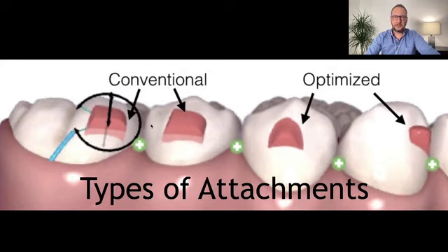The conventional attachments are those that we have available in the software, that we ourselves can place, change the position of, and increase the size of. They have specific shapes, and then we can position them the way we need using this control.